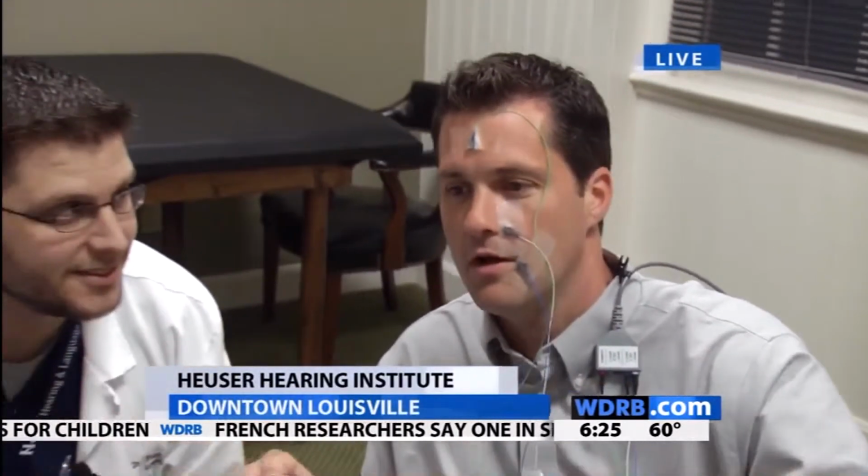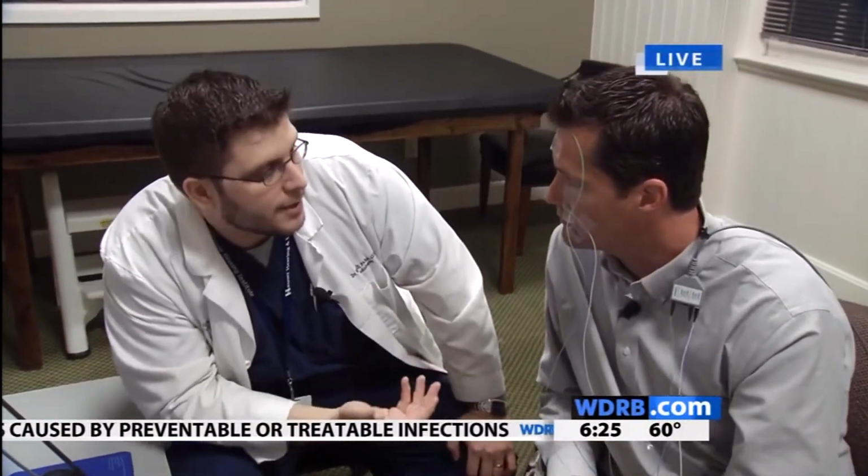Dr. Mitch Campbell, set me up a little bit here on how the facial nerves tie into audiology and the ear. What are we learning here? A lot of times people will have a facial nerve injury, like Bell's palsy, or trauma, like from a motor vehicle accident. So what we can do is test the function of the nerve to make sure that it's still going to get better or if it needs to be surgically intervened, and rule that out as a possibility. All right. So these are sensing what on the computer? These are actually measuring the nerve as it responds to an electrical impulse. The electrical impulse. Yep.